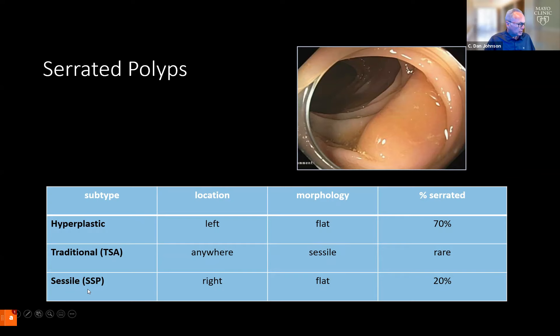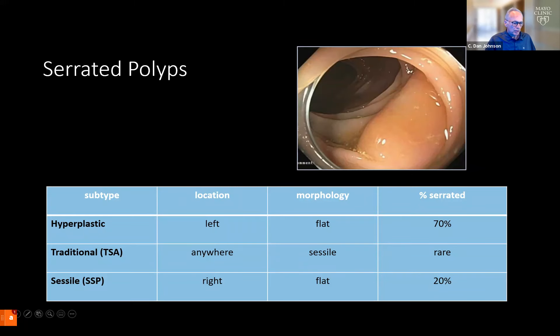The important actors are the sessile serrated polyps, which are most commonly found in the right side of the colon. They're usually flat in morphology and account for about 20% of these lesions.